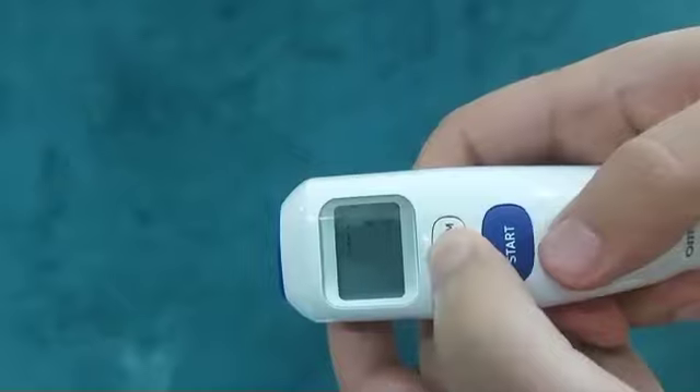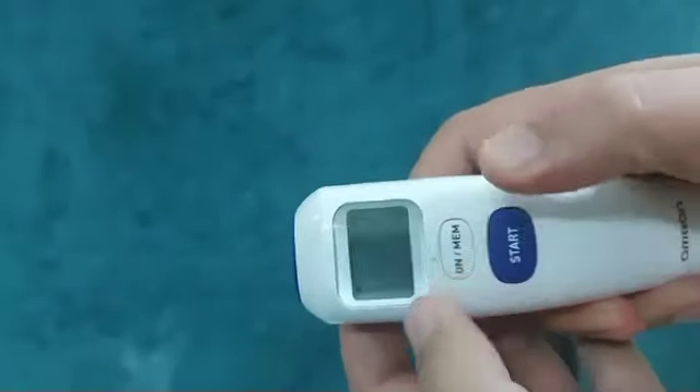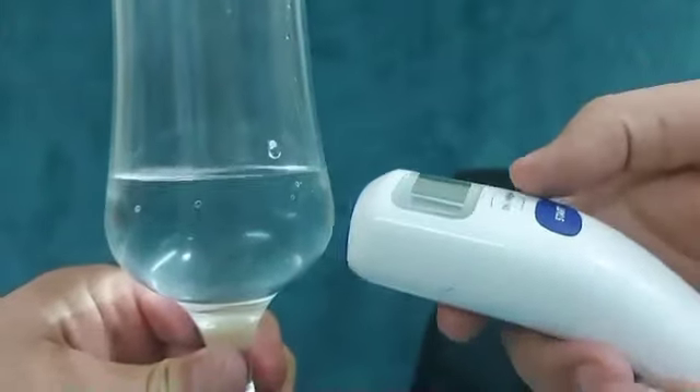To do so, simultaneously push the On and Start buttons. The signal-like symbol will display on the screen, then check the temperature the same as shown in the video.